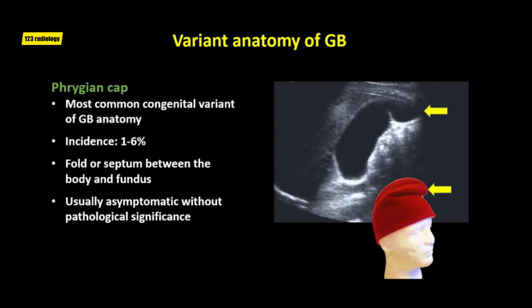The gallbladder can be variable in shape. The Phrygian cap is the most common variant of gallbladder anatomy, occurring in one to six percent of the population. It is named after the headgear worn by ancient Greek slaves as a sign of liberation. This deformity is characterized by a fold or septum between the body and fundus, and is of no clinical significance unless mistaken for a layer of stones or hyperplastic cholecystosis.